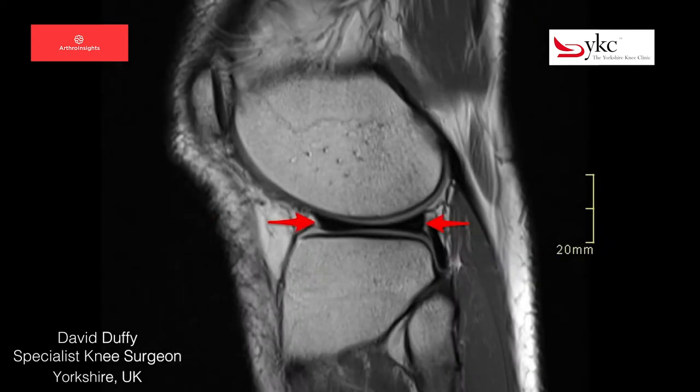When the knee is imaged from the side, or sagittal plane, the meniscus is clear to see. It is the dark structure with a shape similar to that of a black bow tie.